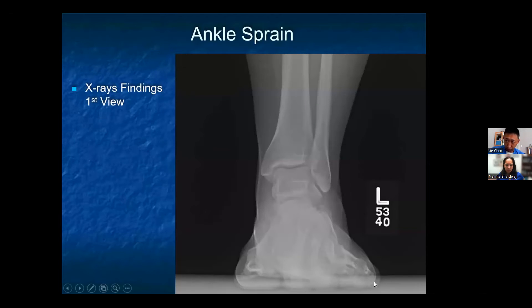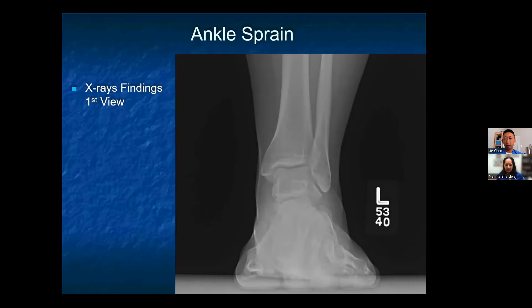Looking at the AP x-ray for an ankle sprain patient: the distal fibula should be slightly superimposed on the tibia, the lateral and medial malleoli should be in profile, and the tibio-talar space should be open — all of which appear normal here. One thing we can see on ankle sprains is an avulsion fracture at the tip of the lateral malleolus, which appears as a small fleck of bone, one to two millimeters in size, just distal to the tip of the fibula. Even though it is technically a fracture, it is more indicative of an ankle sprain and is treated as such.